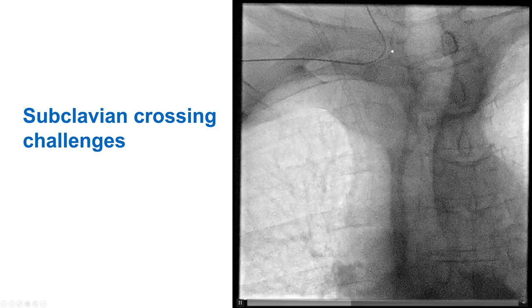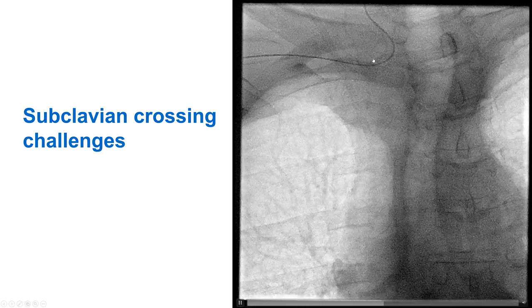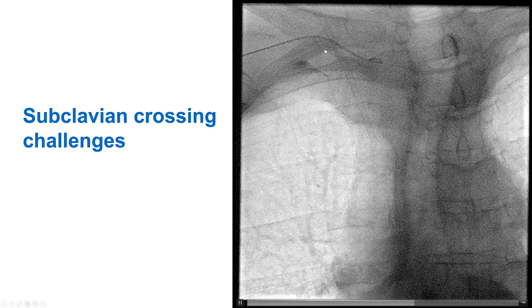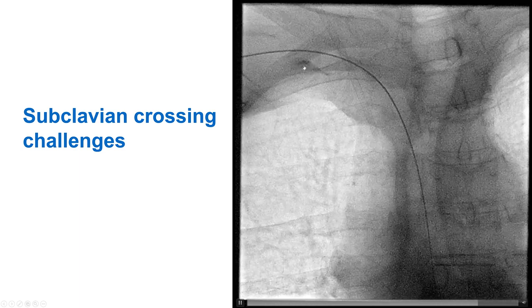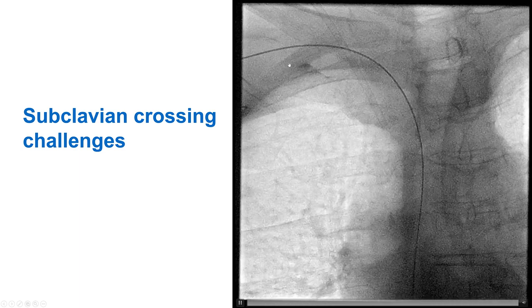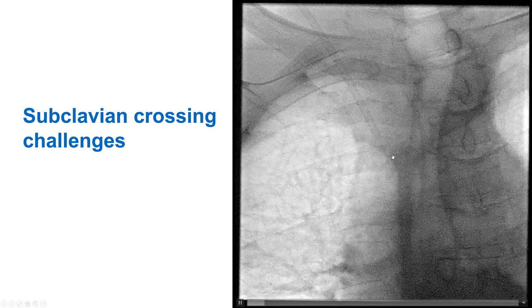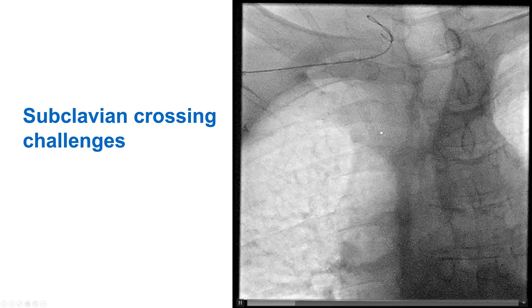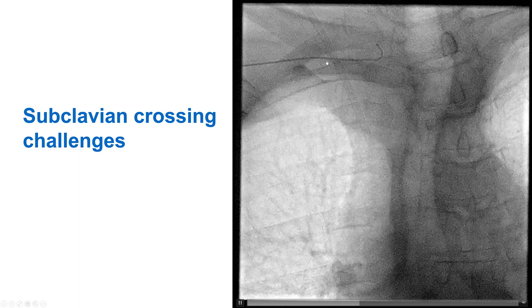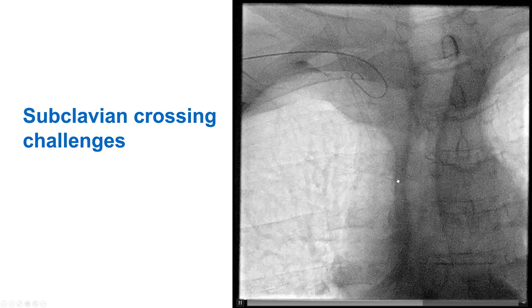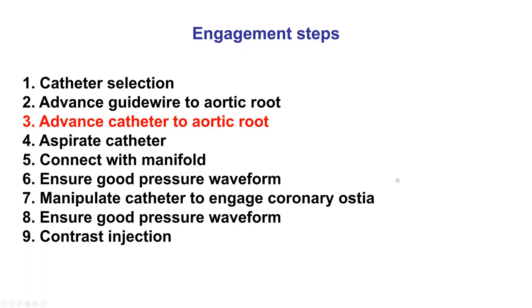Here is an example of difficulty getting through the subclavian — sometimes the wire preferentially goes into the carotid. Eventually, with pulling back, redirecting, and having the patient take a deep breath, entry of the wire into the ascending aorta was achieved.